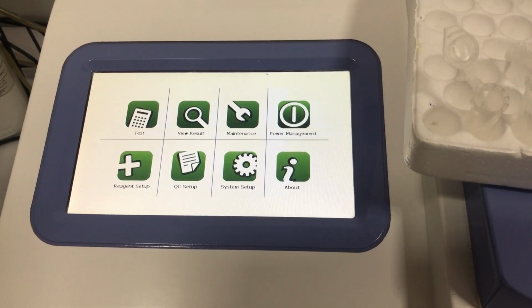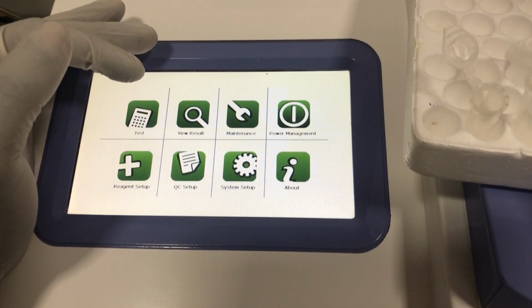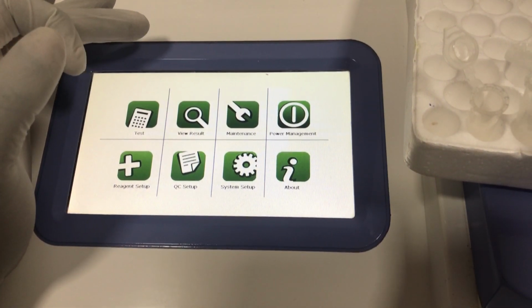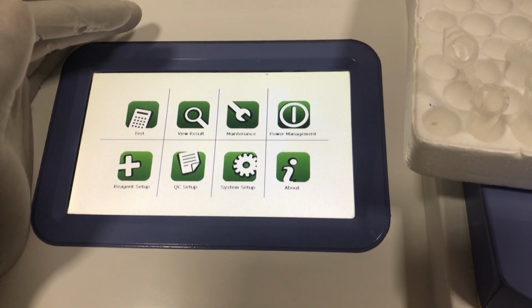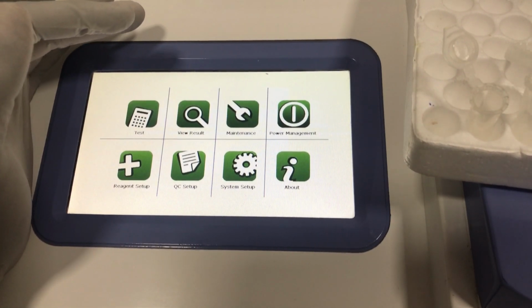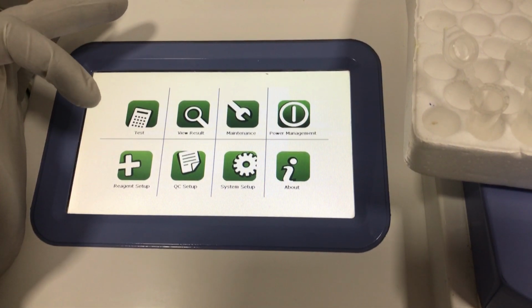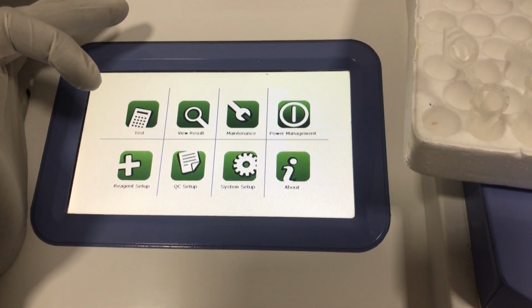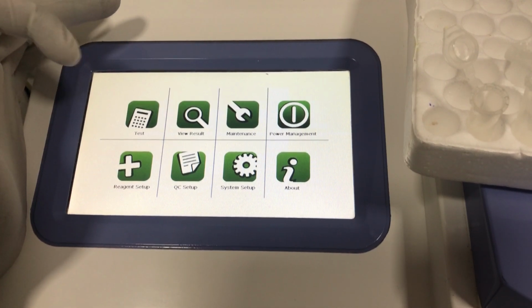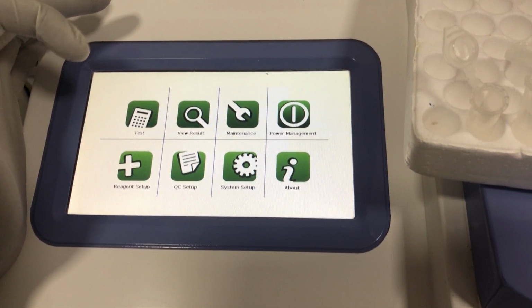In this video, we want to learn how to measure the GGT of a sample. So GGT is basically gamma glutamyl transferase. Okay, so this is an enzyme that is present in the liver and then the biliary tract, and is one of the most sensitive indicators of hepatobiliary diseases.